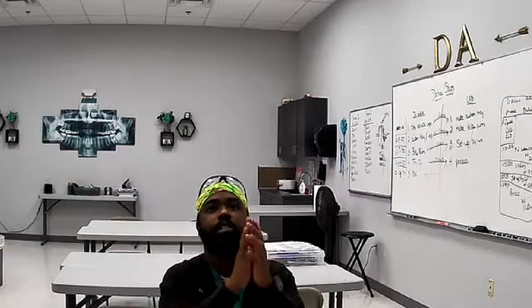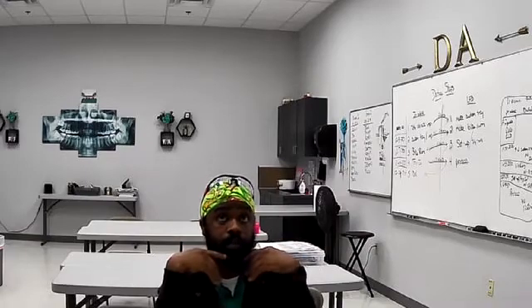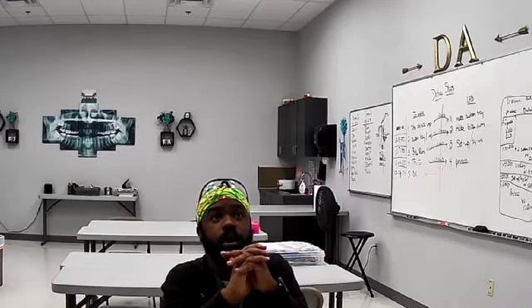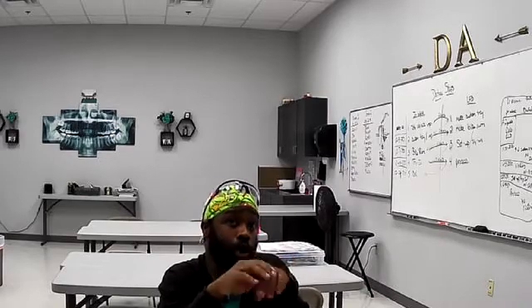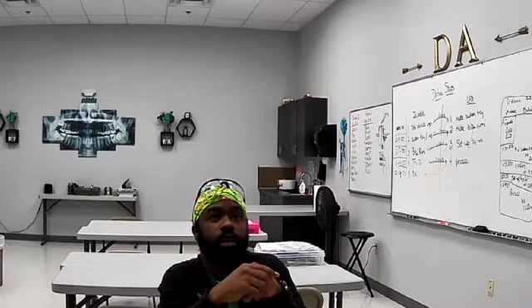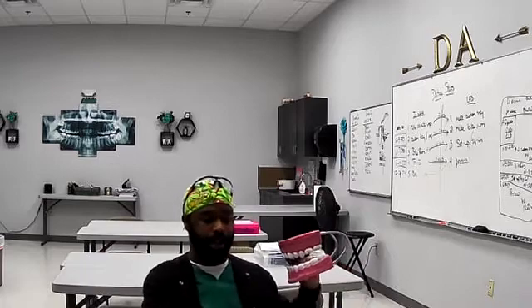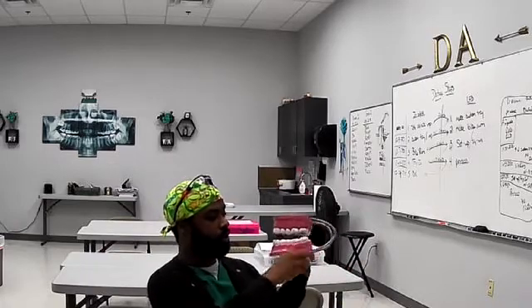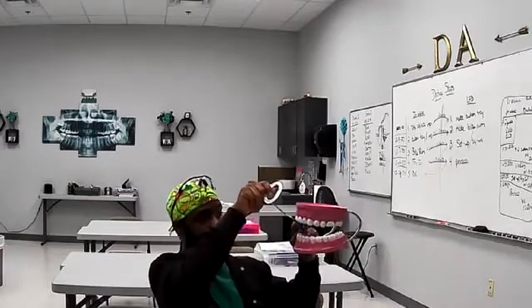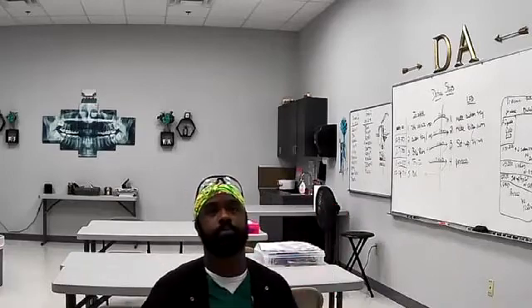Basically, a PA shows everything from the crown, which is the chewing surface, to the root, everything below the gum line. Each periapical X-ray shows a small section of the upper or lower teeth. Okay? And these X-rays are often used to detect any unusual changes in the root and the surrounding bone structures. Again, that's a specific area of the mouth. It's not like a bite wing, where the whole general area gets top and bottom. You're either getting the four top or the four bottom teeth, whichever one.